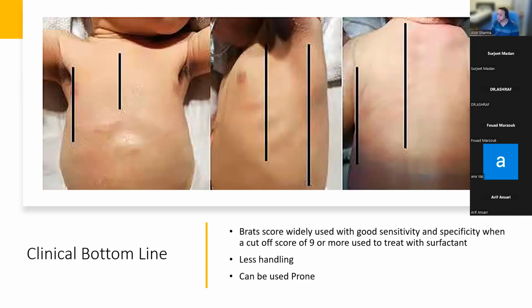My advice would be, for any baby who has a significant oxygen need, I look at the baby and I do a lung ultrasound. A simple example I'll give you: if I've got complete aeration everywhere, my 6-hour ultrasound is well aerated, the subpleural consolidations are less, then the question I'm asking myself is, I don't have an explanation, I don't have a pneumothorax. So it's more used as a modality to exclude other problems. The real question I'll be asking is, is there something wrong with the baby? What is the CRP? Is there sepsis in the background? There's something else that I want to discuss, but I'll discuss it after I show you a case now.